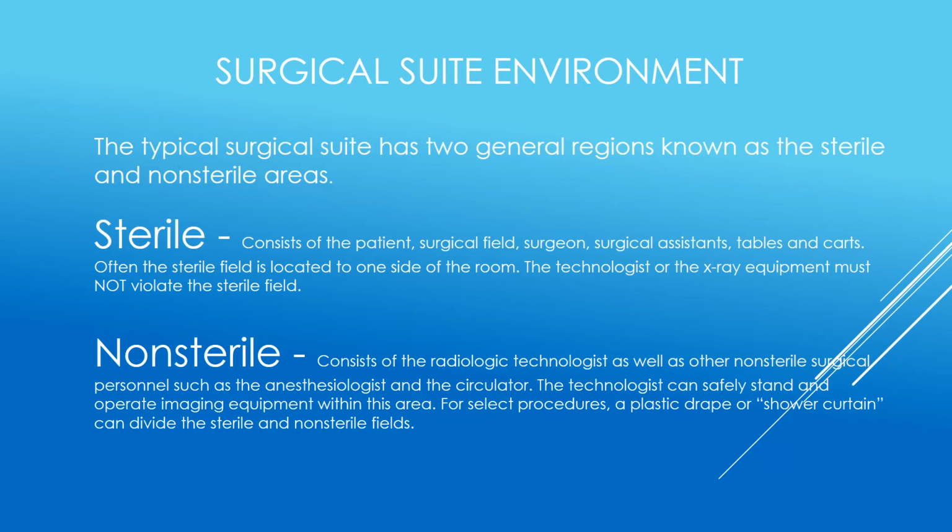Non-sterile. It consists of the radiologic technologist as well as other non-sterile surgical personnel, such as the anesthesiologist and a circulator. The technologist can safely stand and operate the imaging equipment within this area. For select procedures, a plastic drape or a shower curtain can be a divider between the sterile and non-sterile fields.